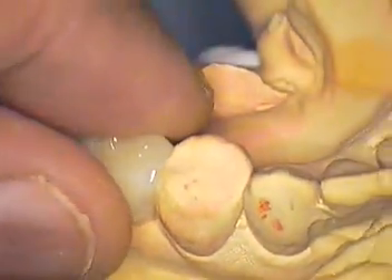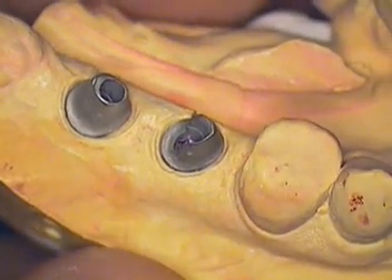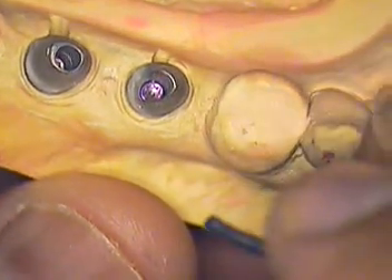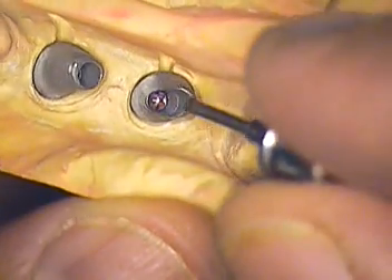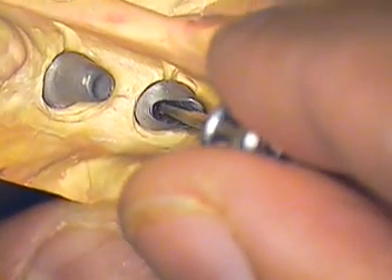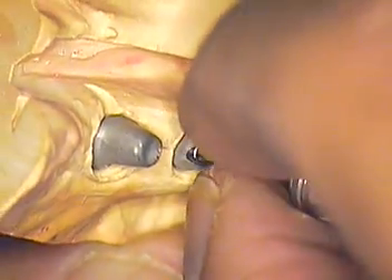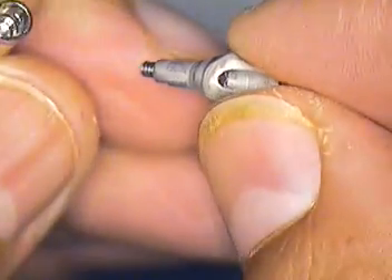Let's take a look now at the actual implant abutments themselves — the custom abutments — and discuss that a little further. On every one of my previous cases that I've discussed on YouTube, the underside, or the submergence and emergence profiles, were very smooth and very highly polished. This case, when I got it back today, happened to be a little different, and I want to show you what these abutments look like.